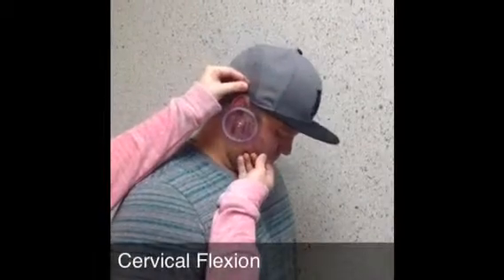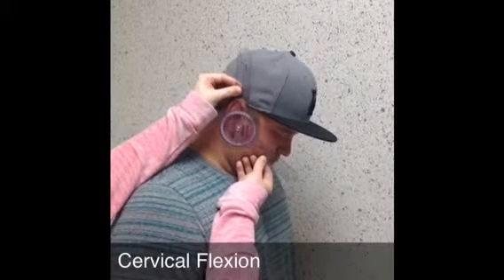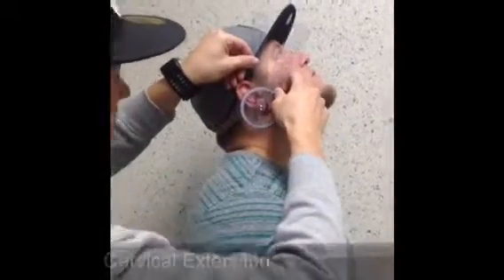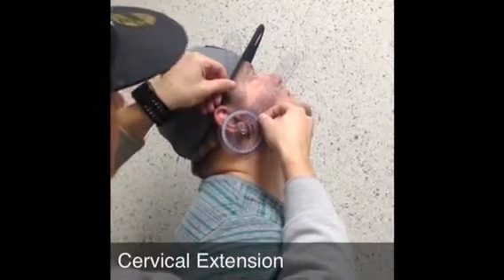For cervical flexion, the axis is placed over the lobule of the ear, the stationary arm perpendicular to the floor, and the moving arm parallel to the nose. Average is about 45 degrees. Cervical extension uses the same parameters as cervical flexion, except this time the patient is extending their neck.